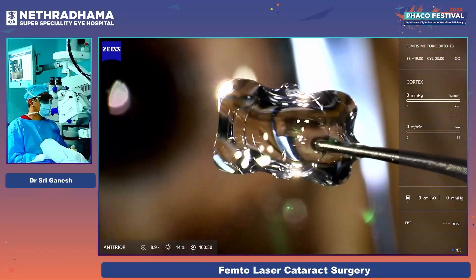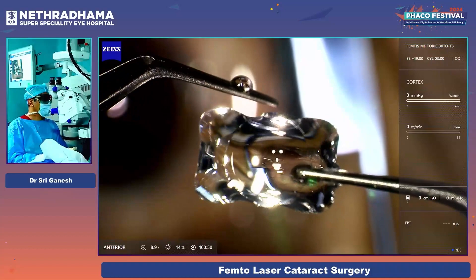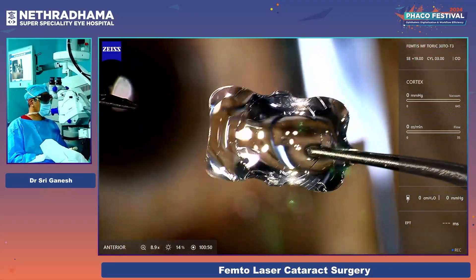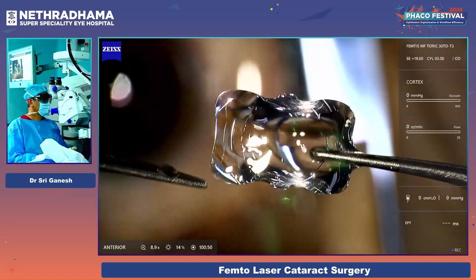You can see that it has four flanges — this is one flange, these are the two side flanges, and the other. So it has four flanges to enclavate the lens into the capsular bag.